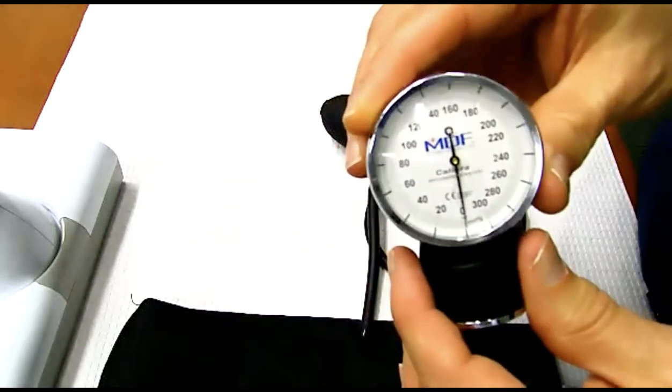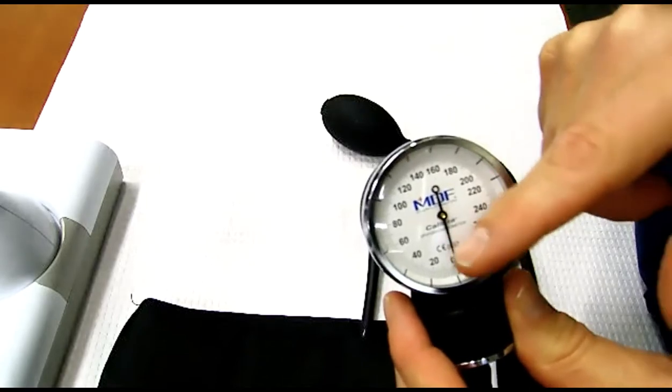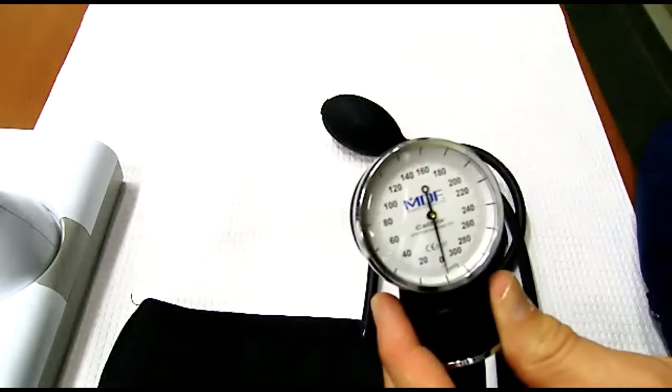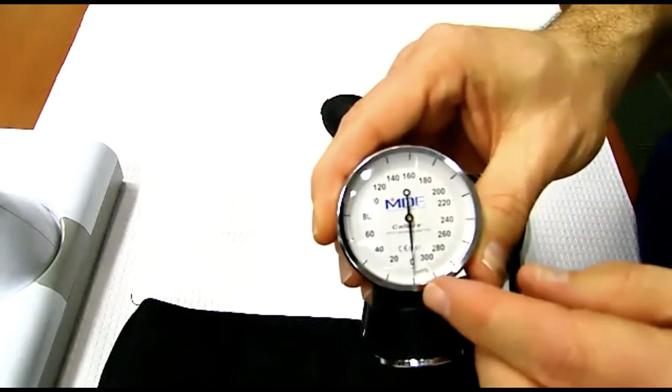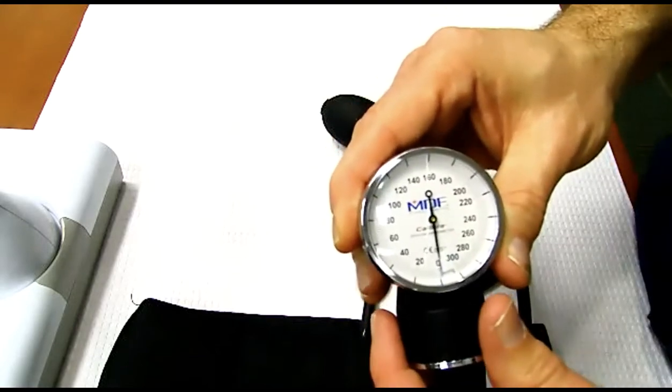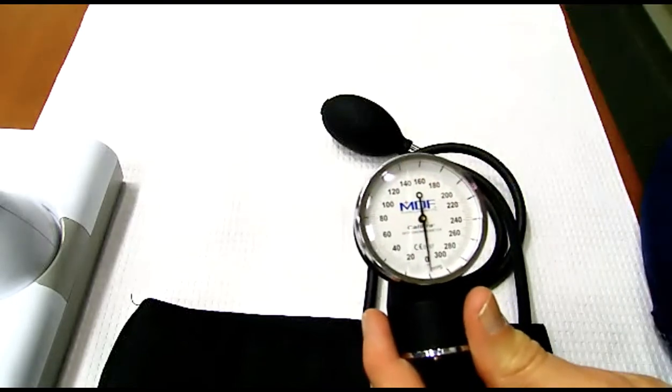Now, here's the deal. It doesn't do any good to take the reading and then get the wrong number off of here. So let's just be comfortable about what you're seeing. Look at the large numbers. The numbers that are actually printed go up every 20 millimeters of mercury: 20, 40, 60, 80, and so forth. All right, but let's look between maybe the 40 and the 60. How accurate can you read?